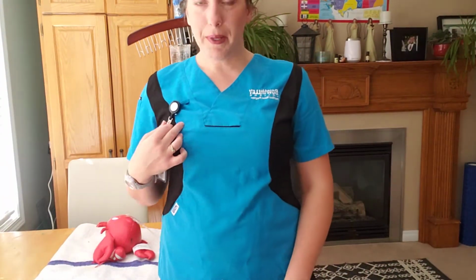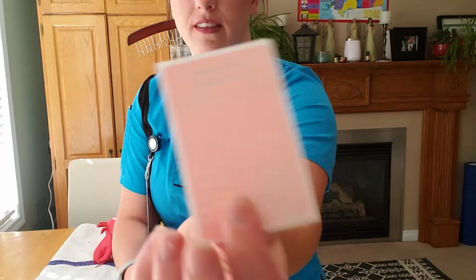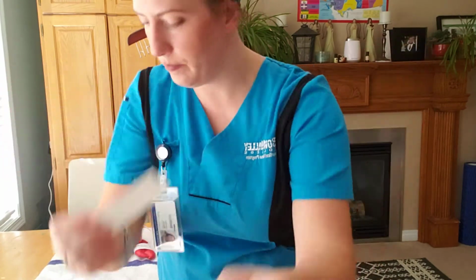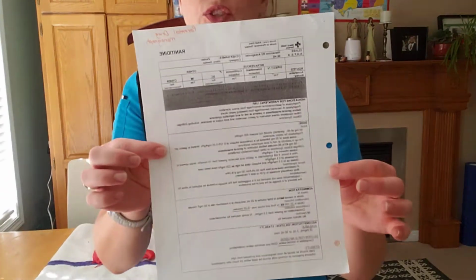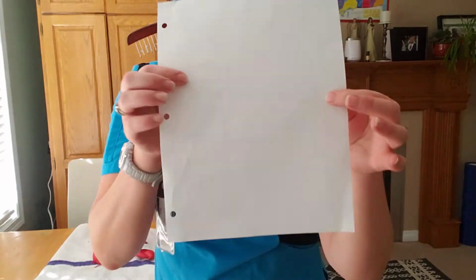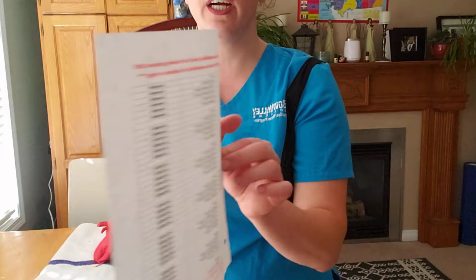I'm going to begin today's video by showing you all my paperwork. Okay, med label. This is the scenario. Drug parenteral monograph, and I've labeled that right here. This is page 2 of the monograph. This is the compatibility chart.